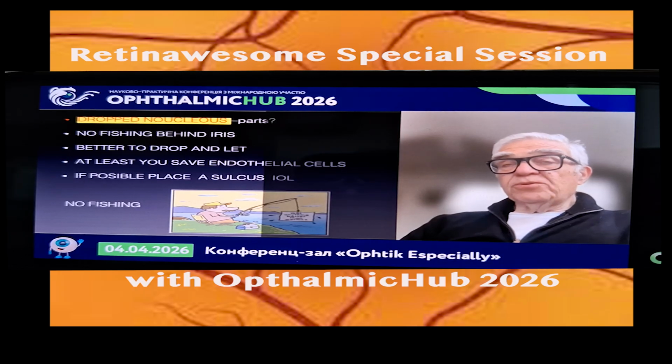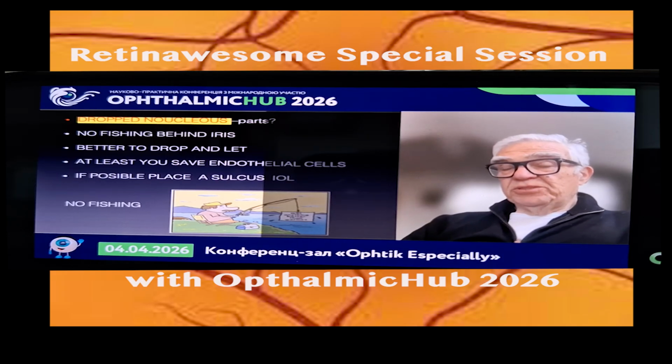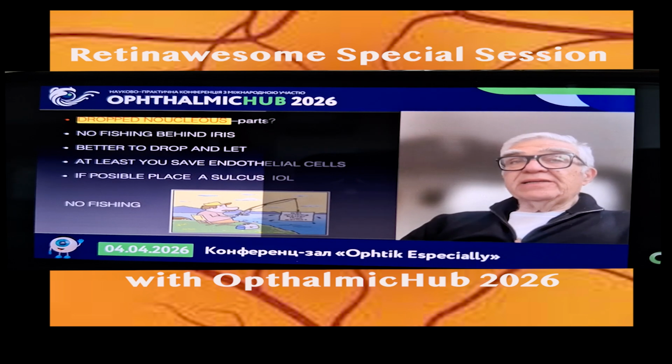And if possible, if you have all the procedures that I told you before, you can put a sulcus IOL at the end of the procedure. Although you left the nucleus in the back of the eye, I would suggest, against a lot of people saying that, a sulcus IOL, because then the patient would be able to see something the next day.